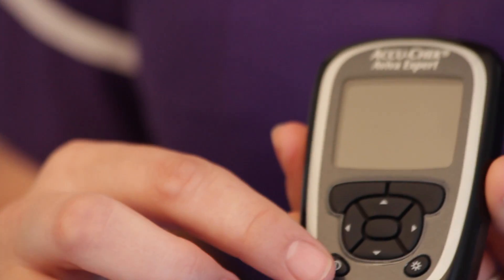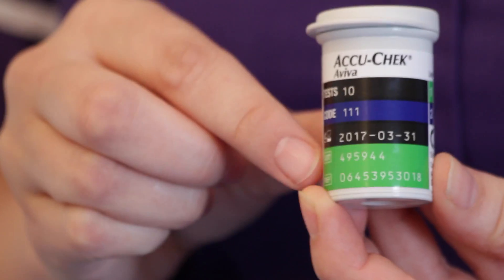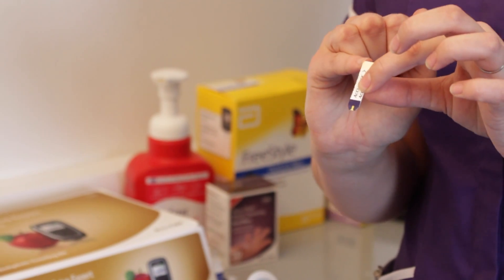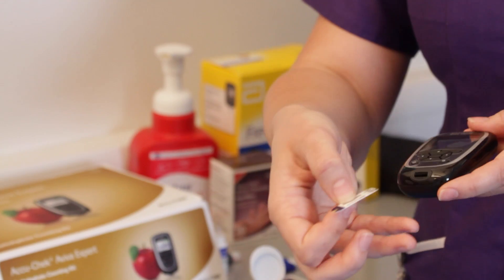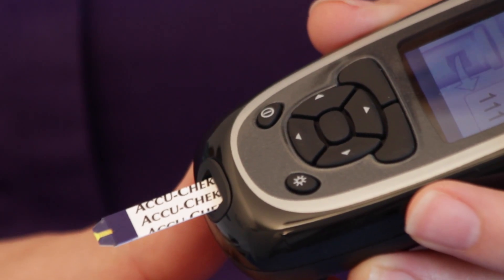With your meter, press your on button. Check that your strips are in date. Your strips will have a microchip end and a straw end. Insert the microchip end into the bottom of the meter and you are ready to go.